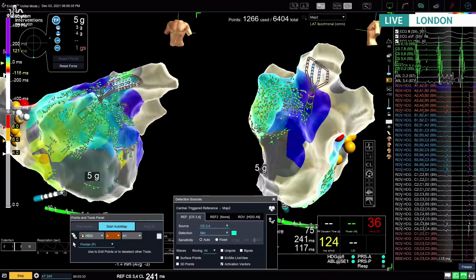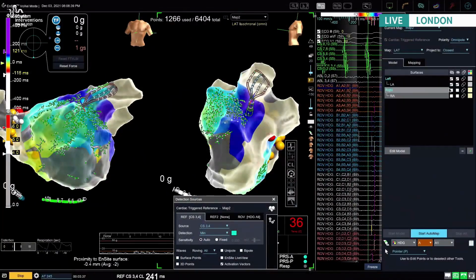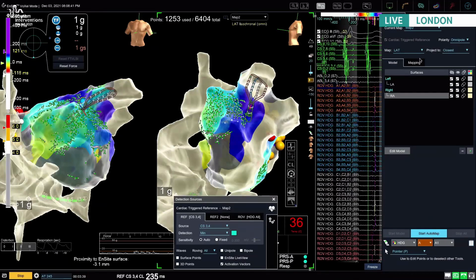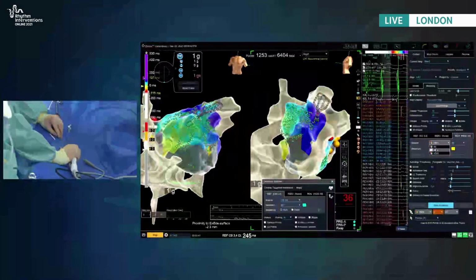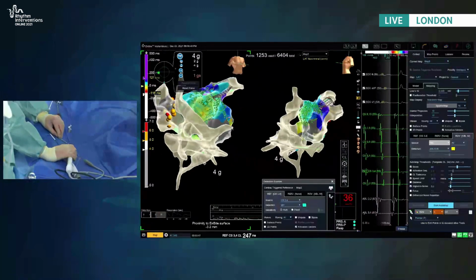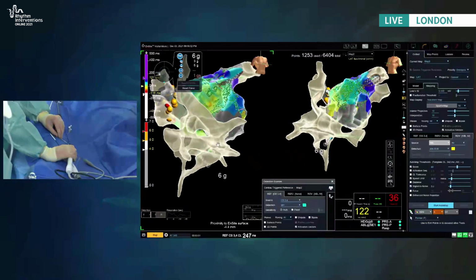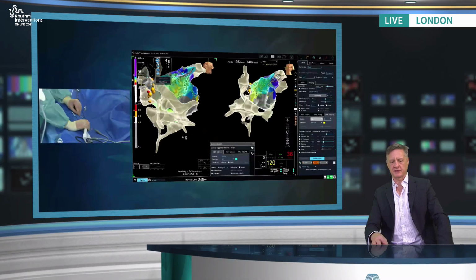Okay, so putting back my map catheter now. So I'll come out to the cava tricuspid isthmus line. Oh yeah, we made a brief right atrial geometry first just to show up our CS. Can we put our map signals between the HD grid and the Deca? Let's see the bar so that you can describe to the fellows what's going on.